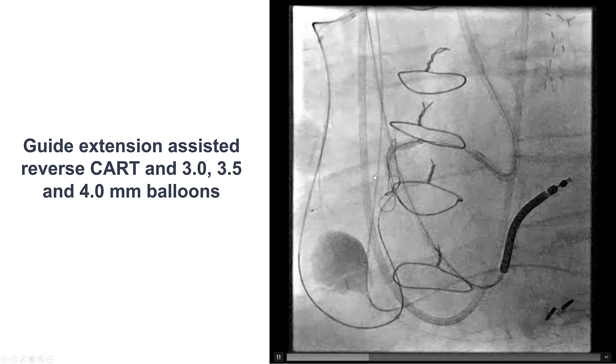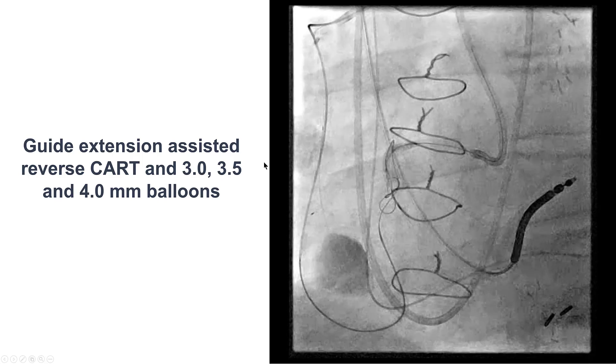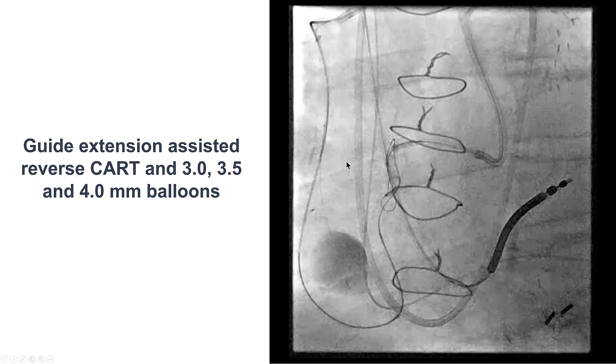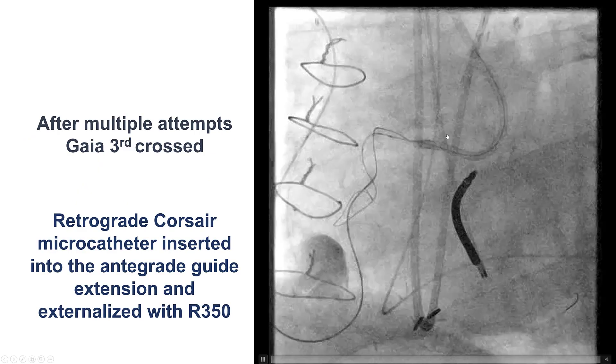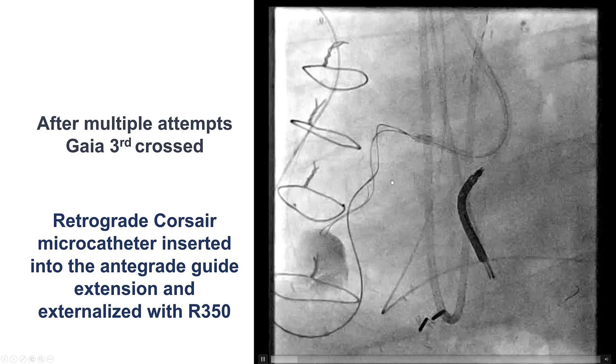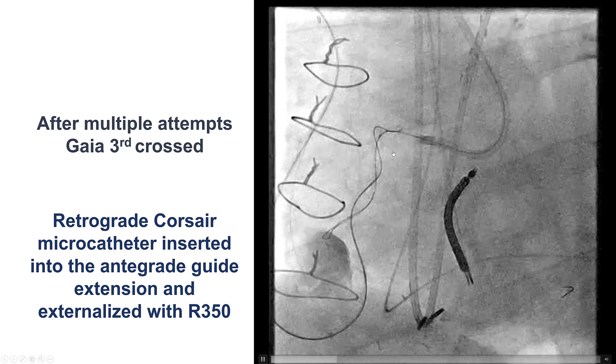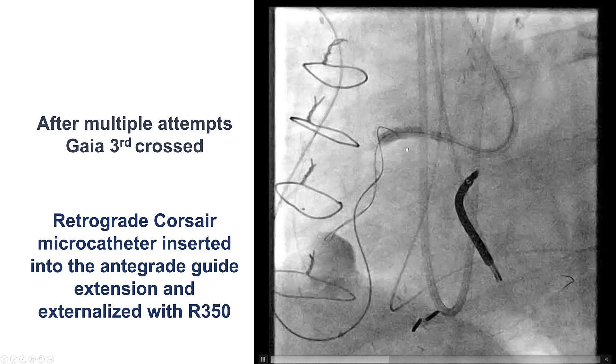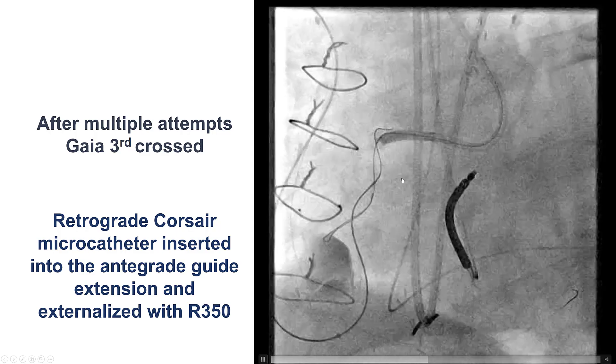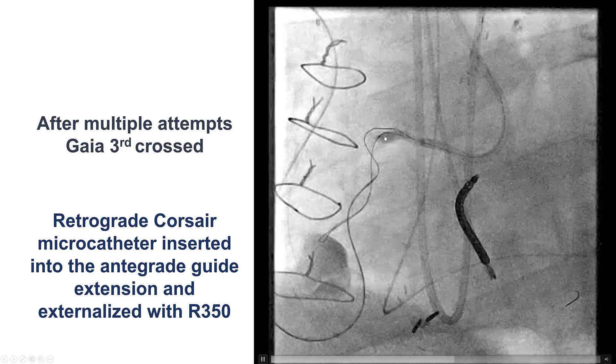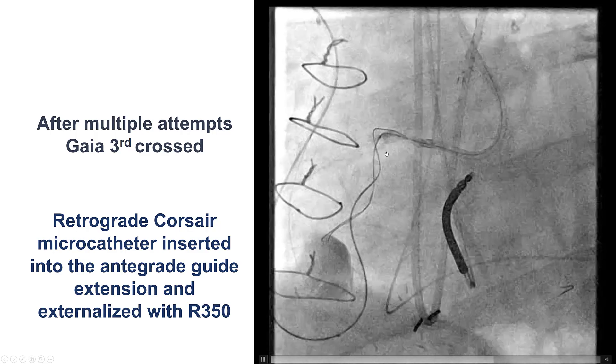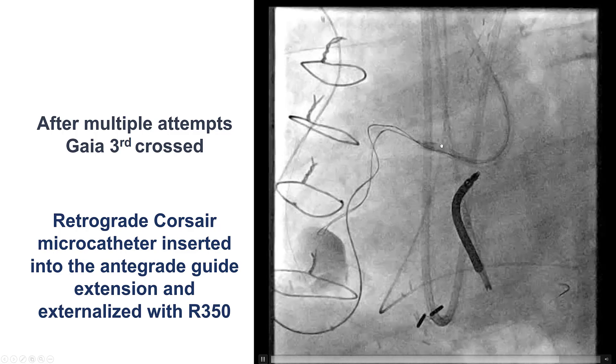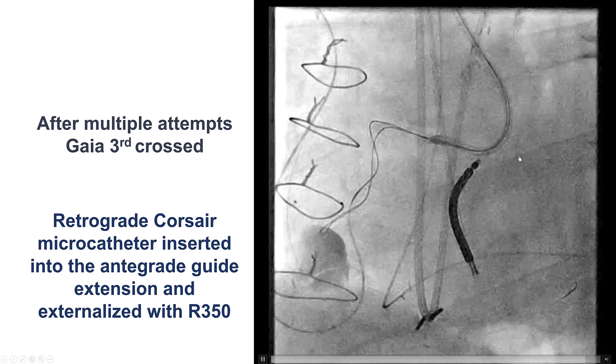We eventually advanced an antegrade balloon and did a guide extension-assisted reverse CART with 3.0, 3.5, and 4.0-millimeter balloons. Connecting the space was challenging, but eventually we were able to cross into the antegrade guide catheter. This is a moment where we're withdrawing the antegrade balloon and advancing the retrograde Gaia guide wire, and that eventually finds its way into the antegrade guide catheter.